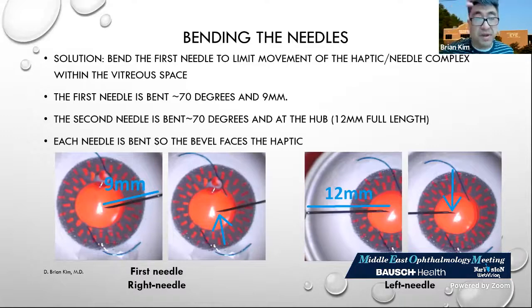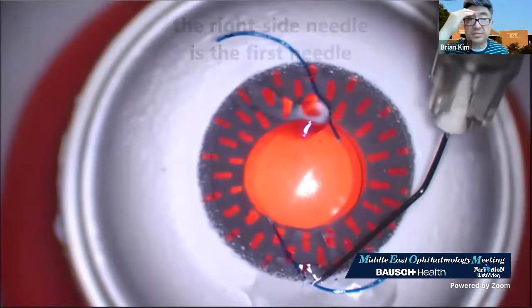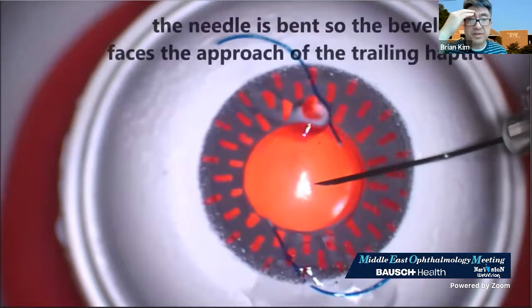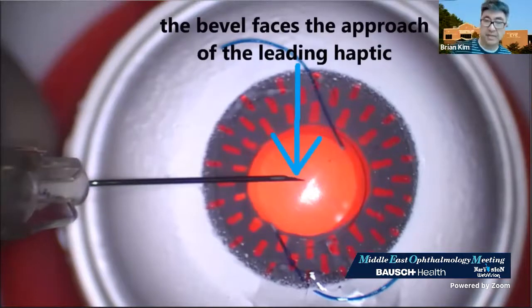The needle is bent so the bevel faces the haptic. And so in this case, the right needle is facing towards the trailing haptic, down, and the second needle, the left needle, is facing towards the leading haptic, which is up in the video here, in the slide. And so again, illustrating the bending. The right side needle is the first needle, and it's bent 70 degrees, 9 millimeters from the tip. And you see the bevel is facing towards the approach of the trailing haptic. The left side needle is bent 70 degrees and full length, and the bevel faces the approach of the leading haptic.